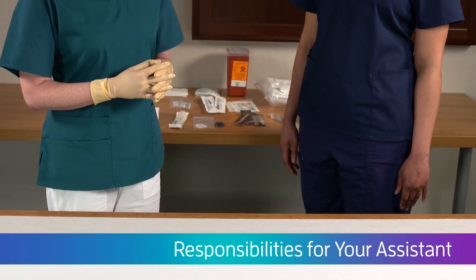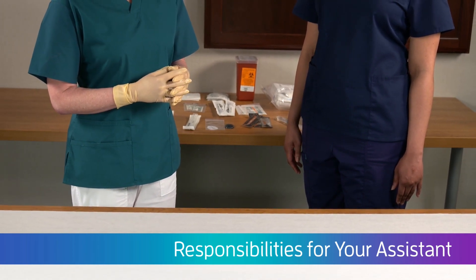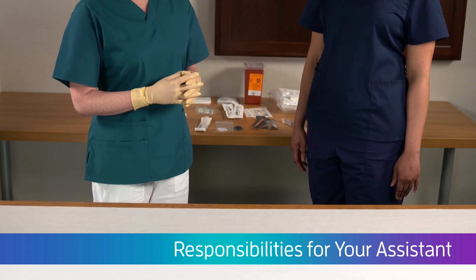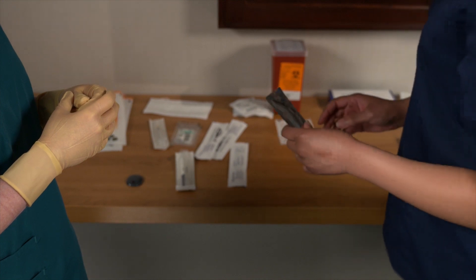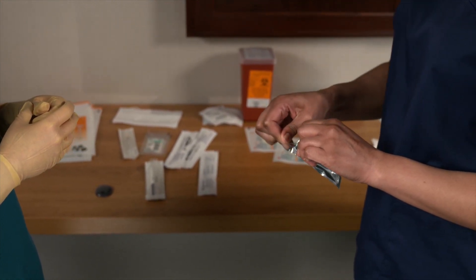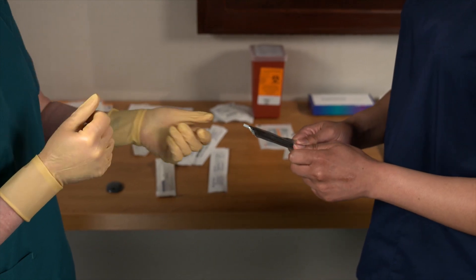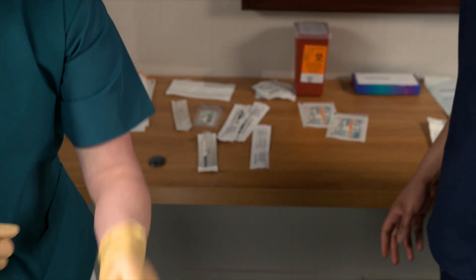Your assistant should take care with the package wrapping so that it doesn't touch the sterile field. Here is how your assistant should present the content of the sterile package to preserve sterility. Open the sterile item by holding the wrapped item in the non-dominant hand, then use the dominant hand to carefully peel the wrapper away. Your assistant should dispose of all outer wrapping that is not sterile.